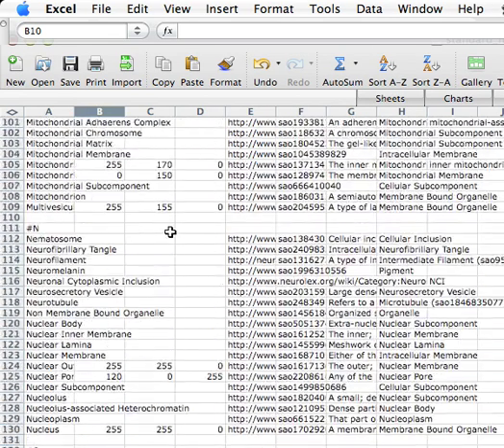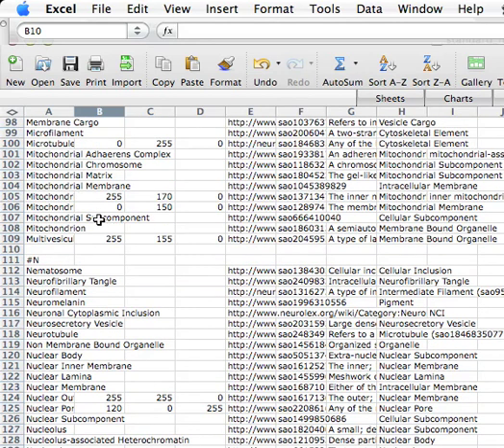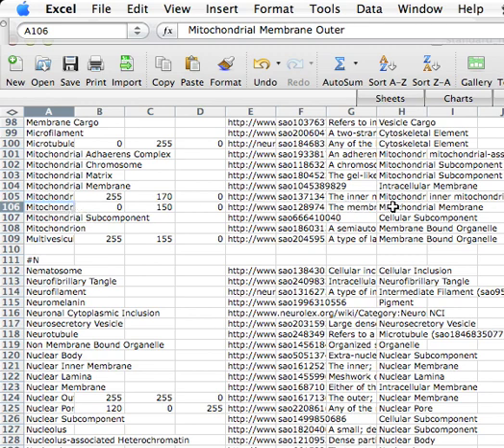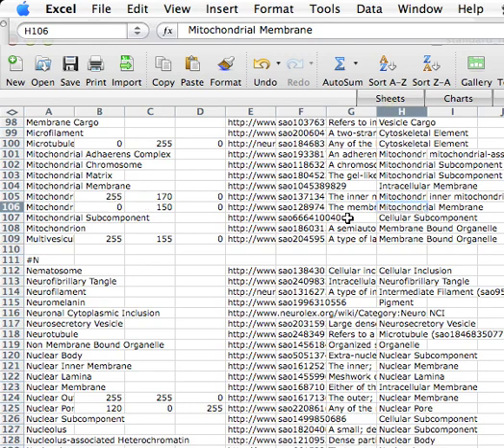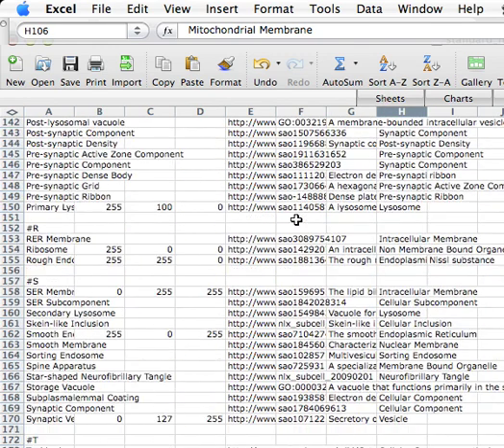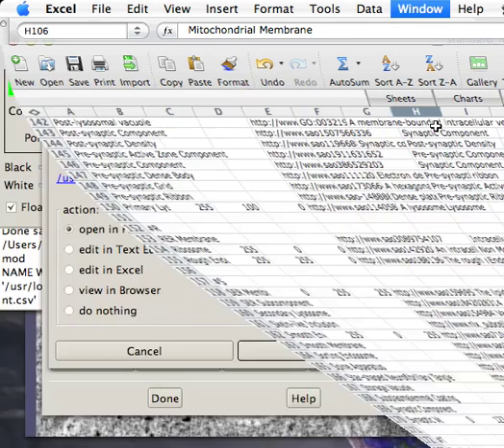One you'll use quite often, I believe, is mitochondrial membrane outer. You'll notice that is actually outer membrane. The supercategory is mitochondrial membrane and so forth. Feel free to open this and add your own. I'm just going to hide it now.